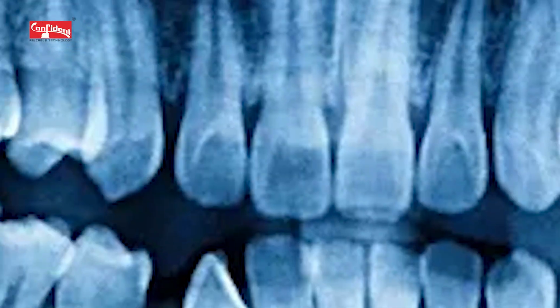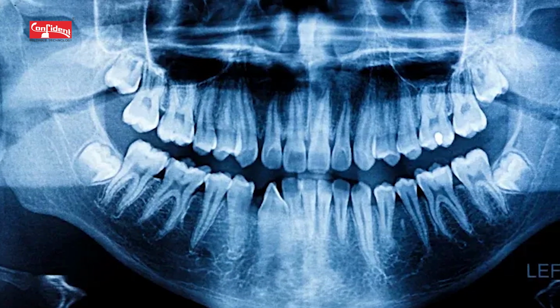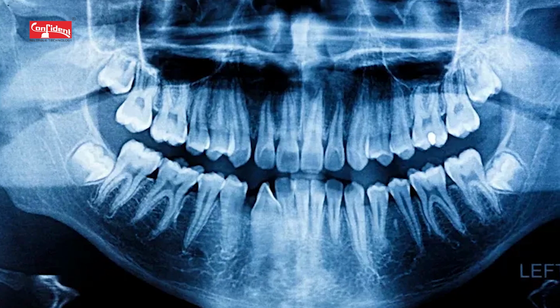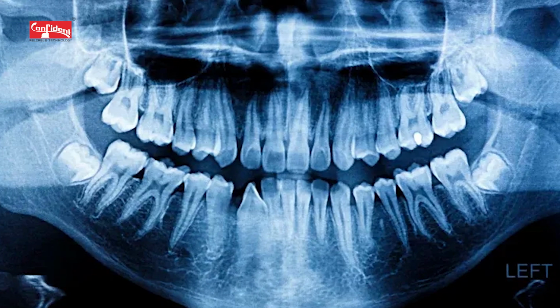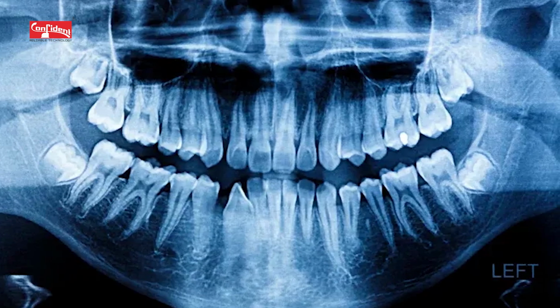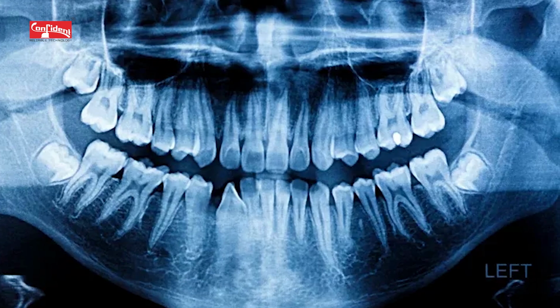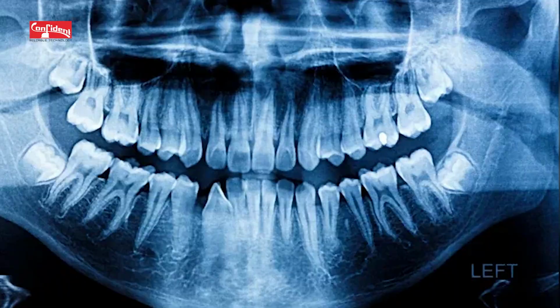But in relation to the clinic, the undergraduate program or private practice, when we wanted to view the whole of the maxilla as well as the mandible, where assessment of all the teeth has become very essential to treatment, we have something called an OPG, or panoramic radiograph, which forms a stable radiographic image that helps us assess both the maxilla and mandible at the same time.